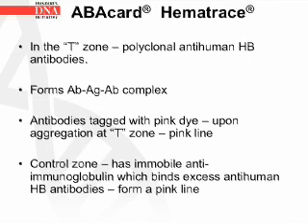There is also a control zone, which has immobile anti-immunoglobulin, which binds excess anti-human hemoglobin antibodies, also to form a pink line.